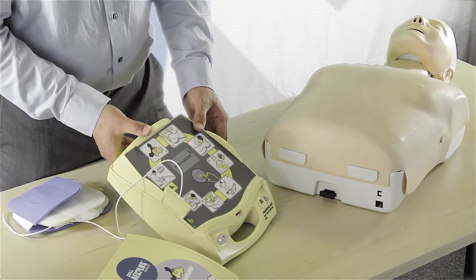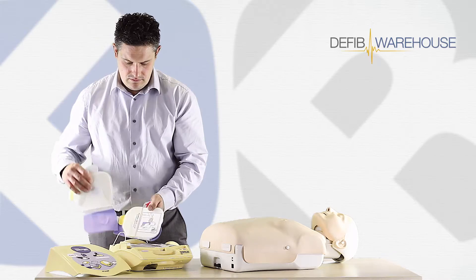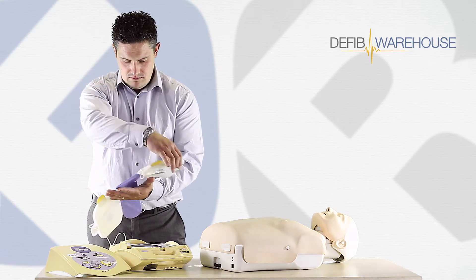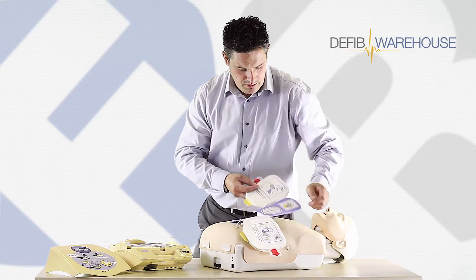Check breathing. Attach defib pads to patient's chest. You can see our pads, so we'll pop these on the chest.